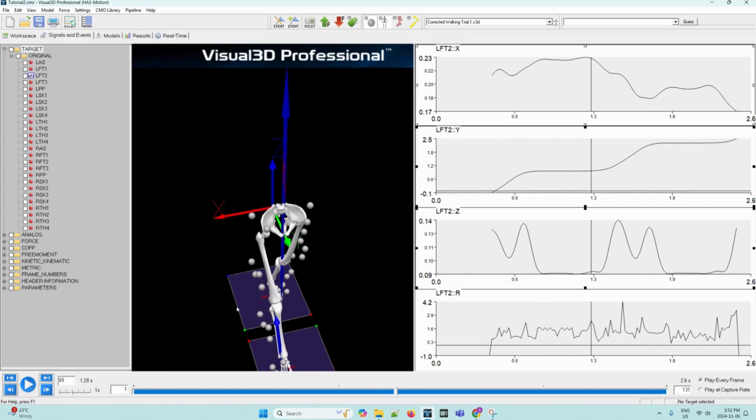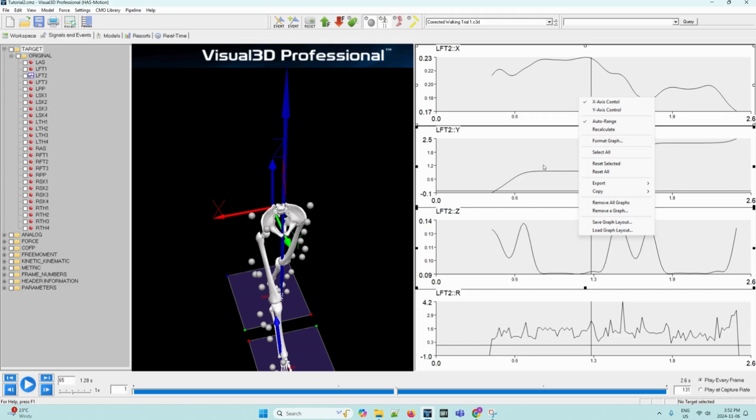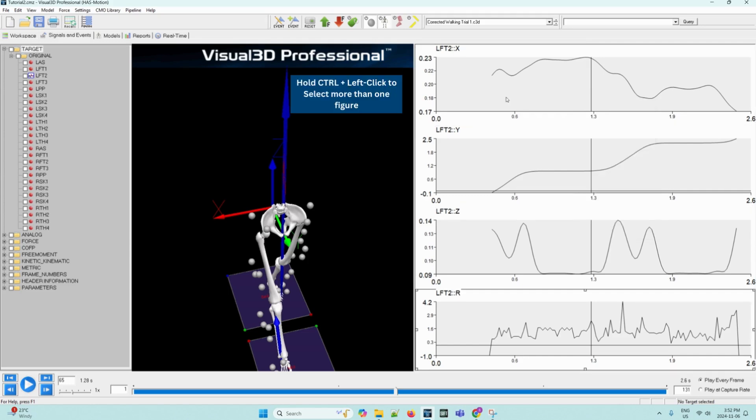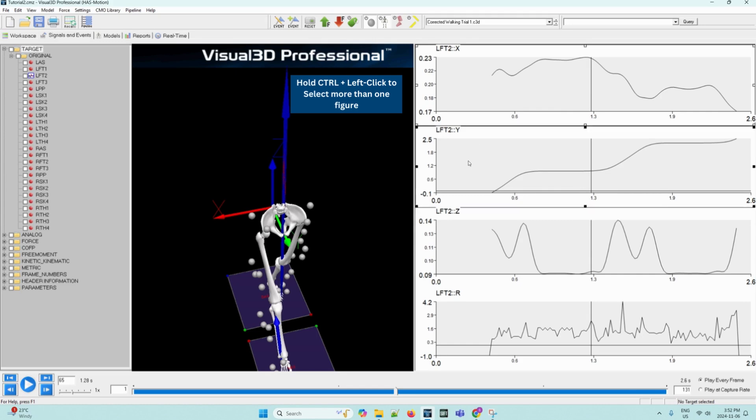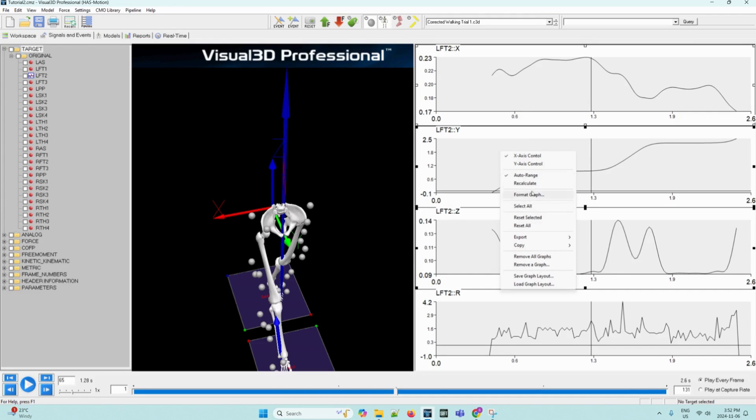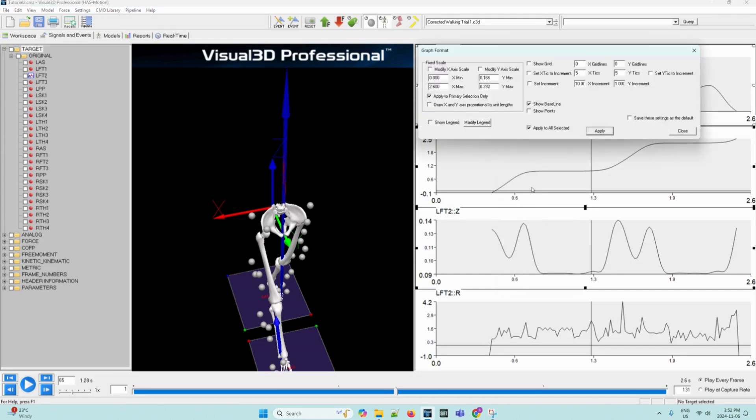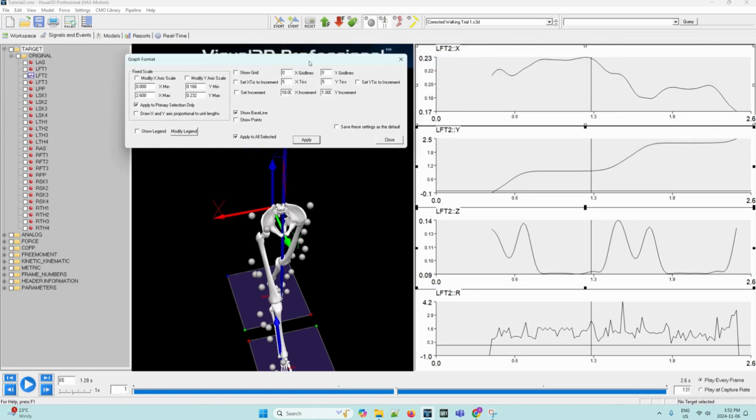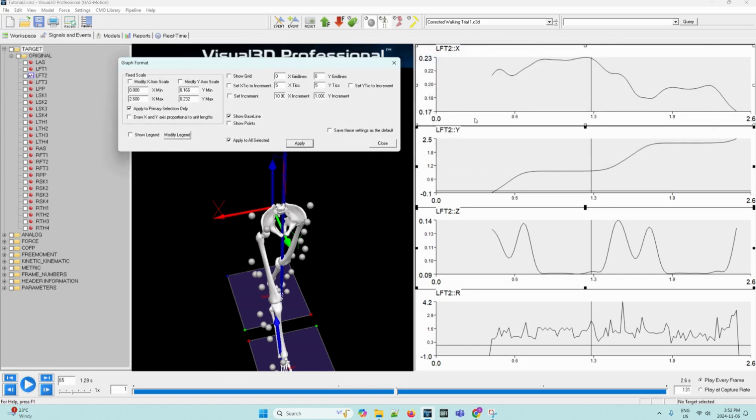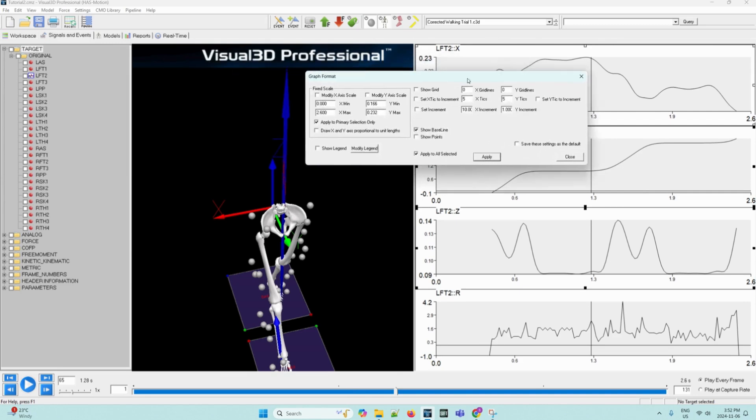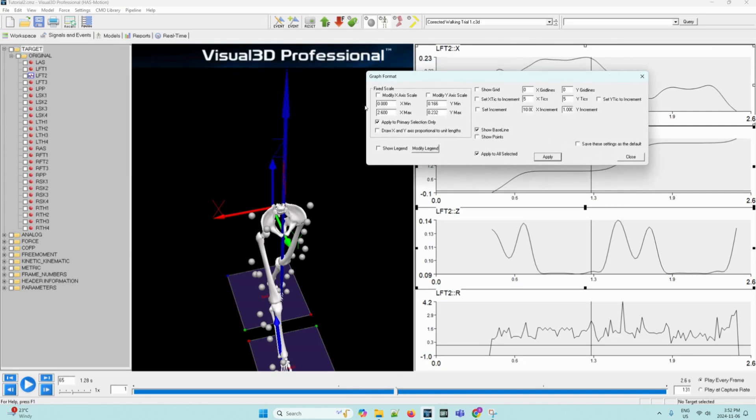To format the signal graph, we can right click anywhere on the graph to open an option menu and then select format graph. If you want to select more than one graph, we can hold down control and select multiple. Now we can right click down again and then select format graph. Any changes that you make in this graph format dialog box will apply to each of the graphs you selected. So in this case, the X, Y and Z graphs will all be affected by the changes we make in the graph format dialog box. It is up to you, the user, on formatting your own graph.